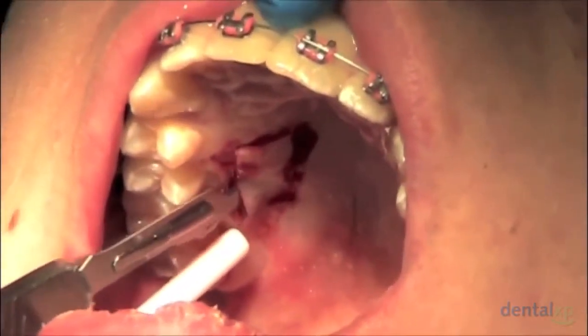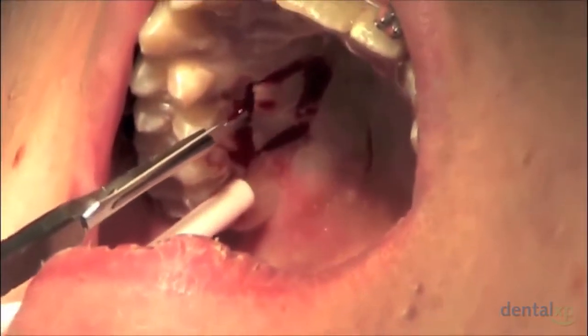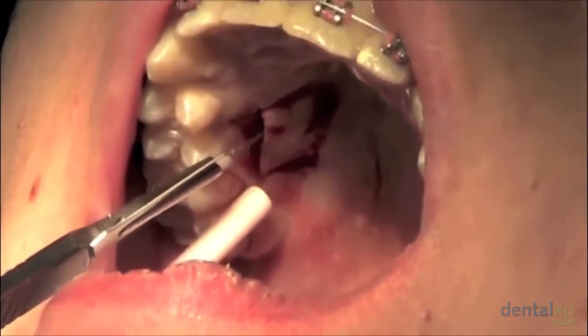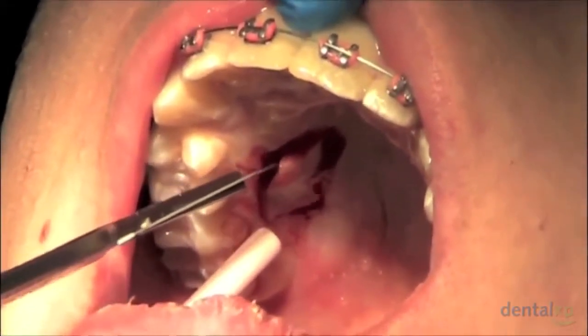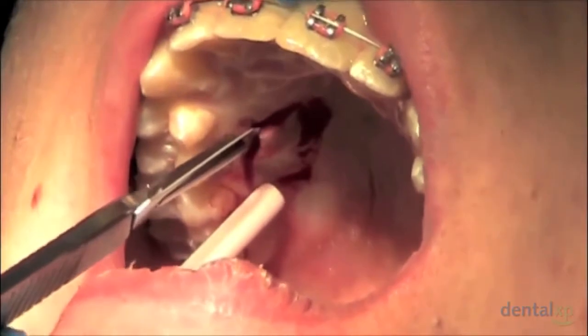As I'm sharply dissecting the donor tissue away from the palate, one thing I want to point out from an assisting standpoint is I like to have my assistant put the surgical suction tip at the distal edge of the wound. That way all the blood will flow downwards using gravity and out of my line of sight.